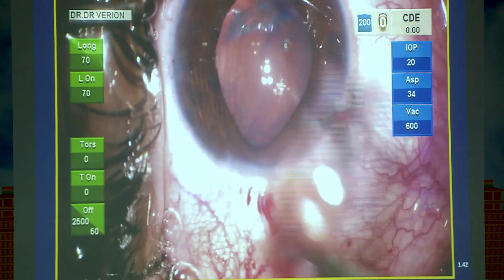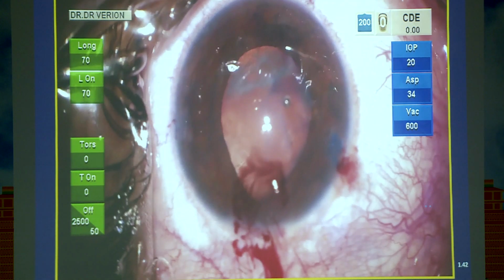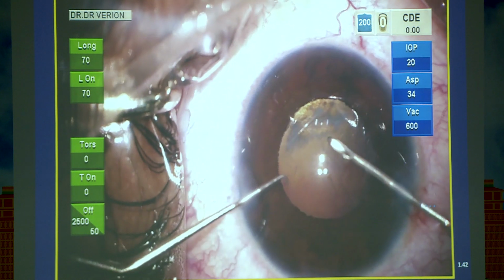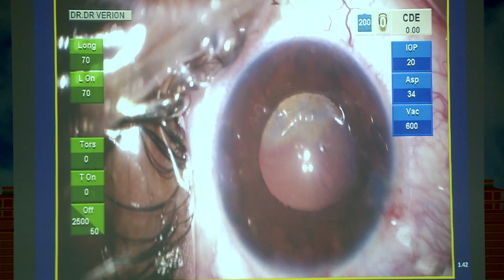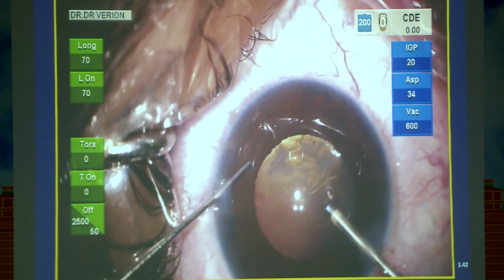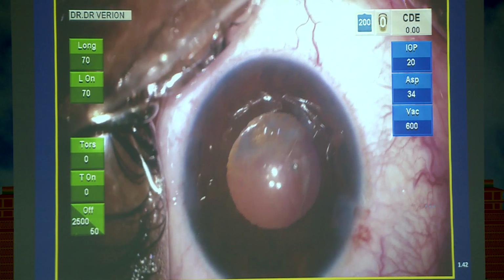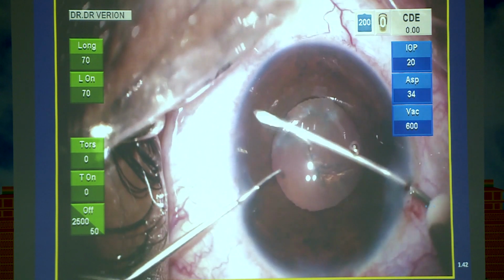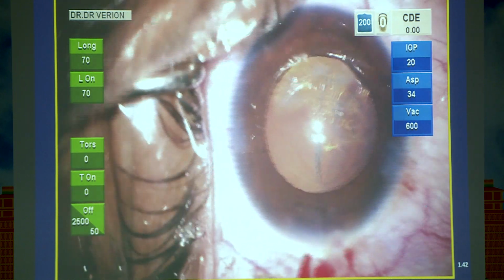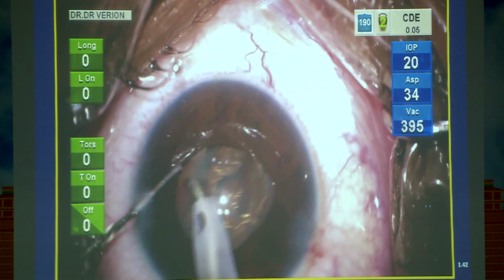And you can see the ASC cataract that is impinging onto the center, that's causing a drop in the visual acuity. Most often these patients, that was a patient who had a minus 27 diopter power to begin with. It's always a good idea to stain these capsules, because invariably there is anterior subcapsular fibrosis. And when you run into these areas, it's essentially a capsulorhexis forceps, the capsulorhexis, whatever you are comfortable with. It's important to get an intact capsulorhexis, because you require a good overlap of the rhexis margin over these very soft cataracts in these highly myopic eyes.